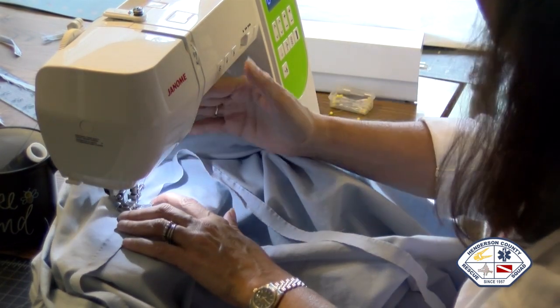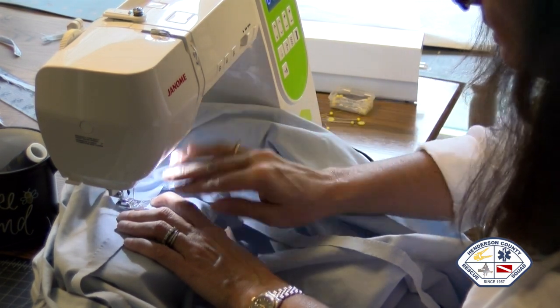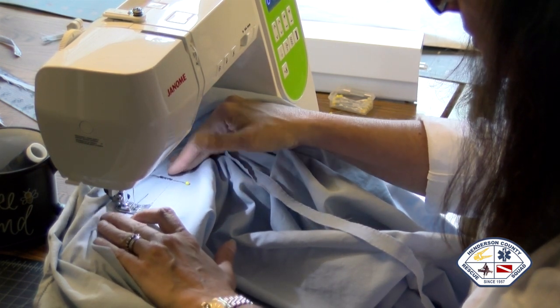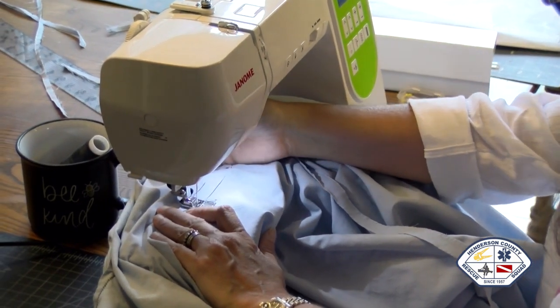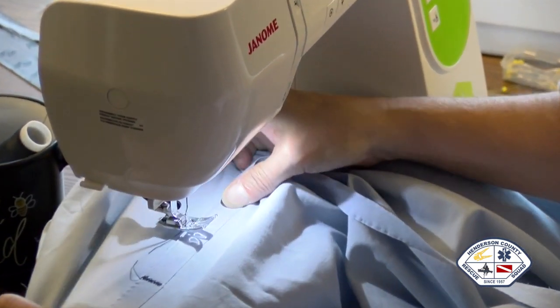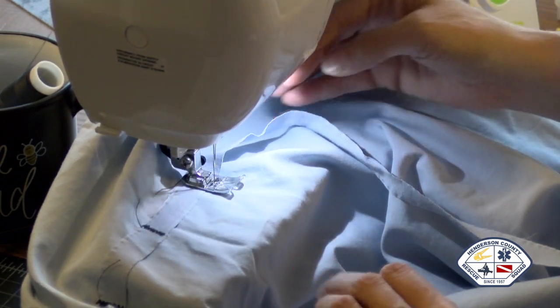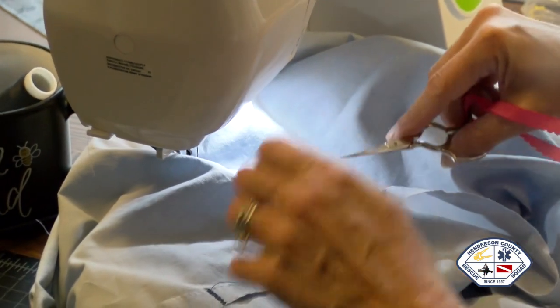Okay, right now we're in the center. Oh, wait a minute. I didn't hear it cut. There we go. Let's scooch over this way a smidge. Perfect. And we'll go this side. Let's see here. About there. How about that? And back up and back down. Perfect. Okay, let's trim off these ends.